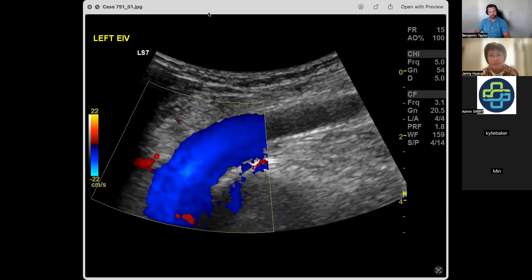We're doing a Valsalva maneuver. I think we're potentially doing a dynamic maneuver. That's actually just normal breathing. But doing dynamic maneuvers can demonstrate complete occlusions, proximally or distally, depending on what the maneuver is that you're doing. So the flow's moving away, in the normal direction.